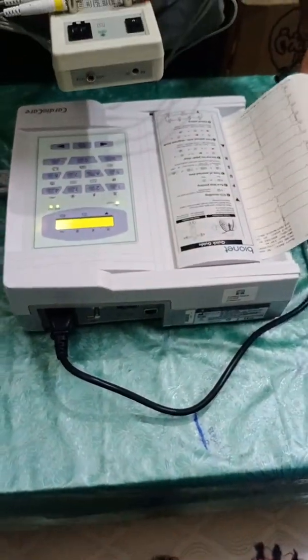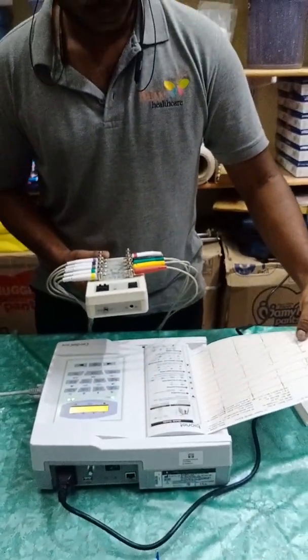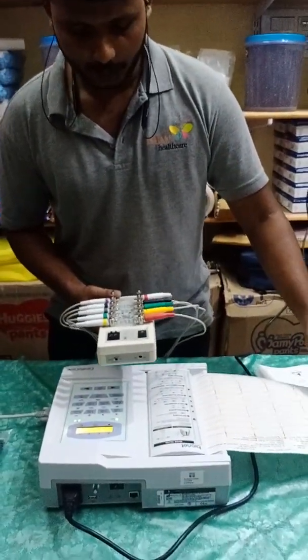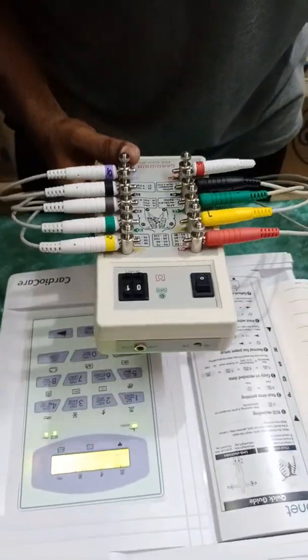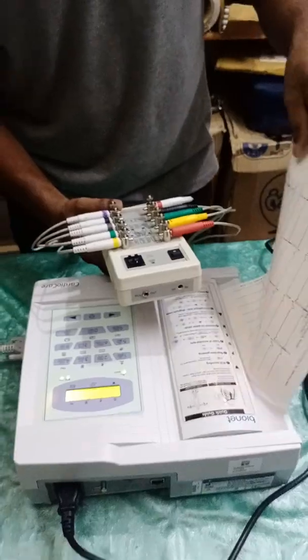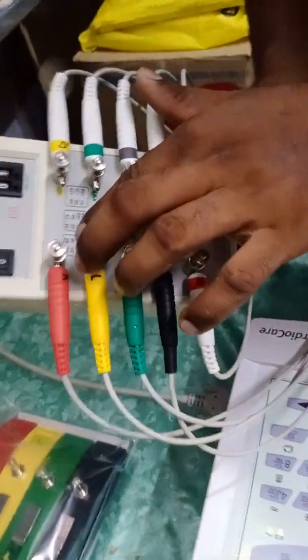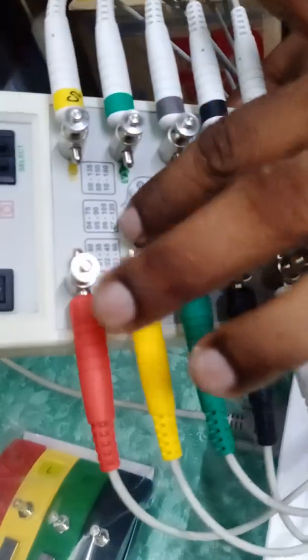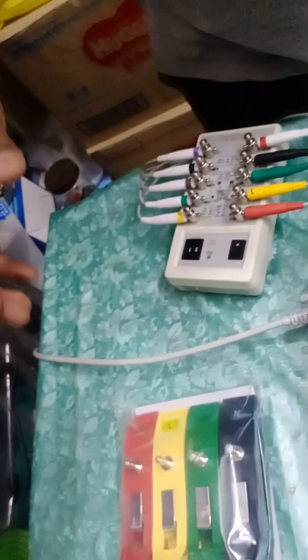I should clarify — I had actually set the simulator to 30 BPM, not 60, because I entered code 01 which corresponds to 30 BPM. Looking at the printed data, you can see it is clearly rated as 30 BPM, confirming the machine is completely calibrated.